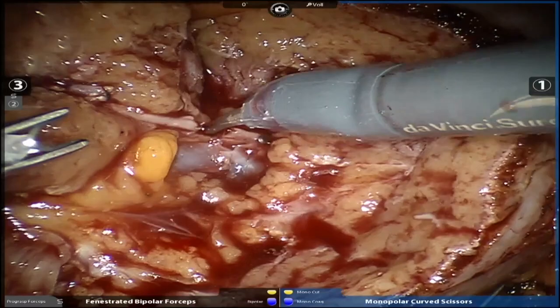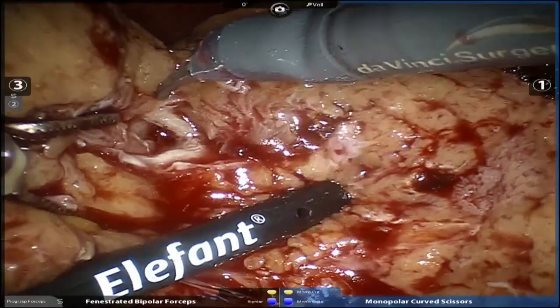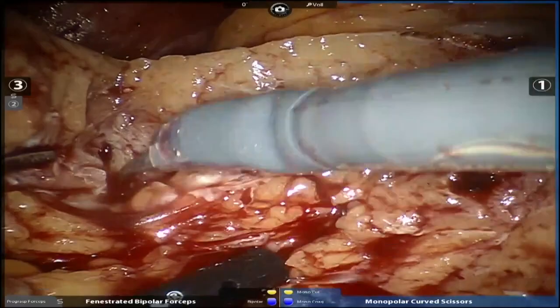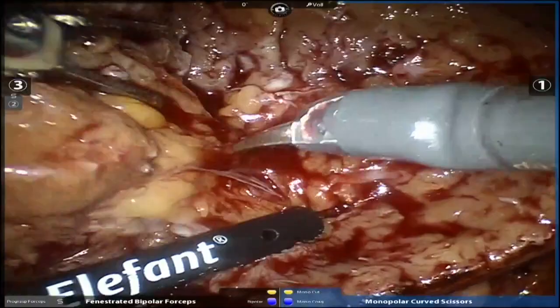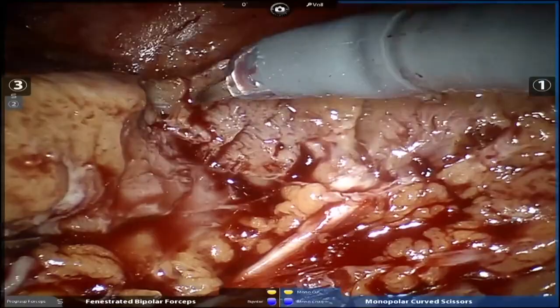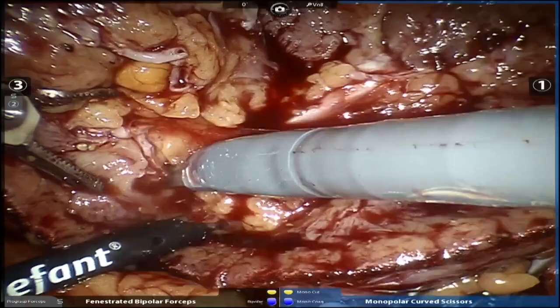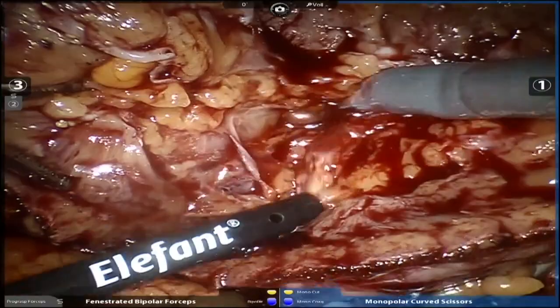We're just going to go across that giant vein. We're going to suture that later. So you know, the technique kind of changes when you get in the base, cutting through the cortex, and then when you get into the sinus, it's more blunt dissection. Collecting system. There's tumor there.